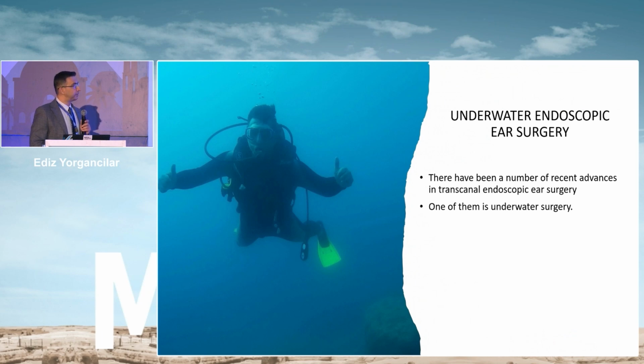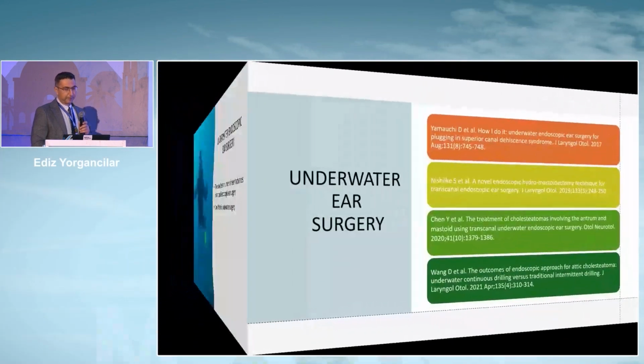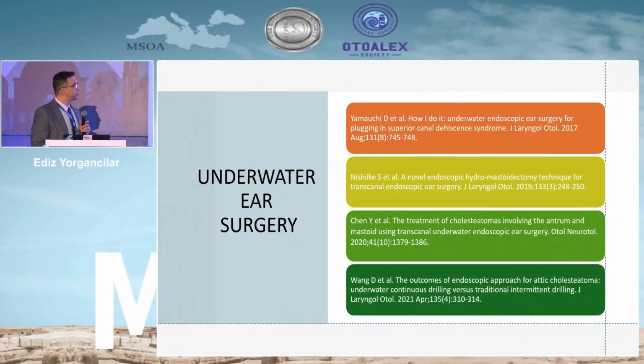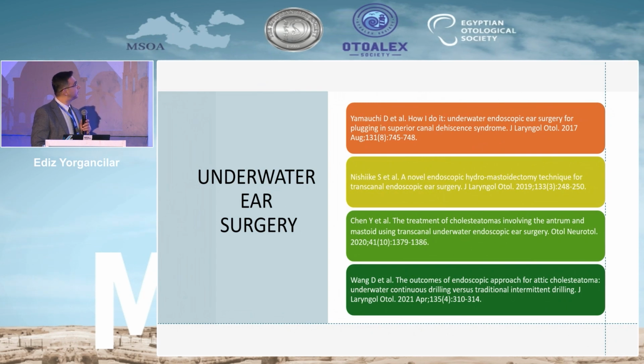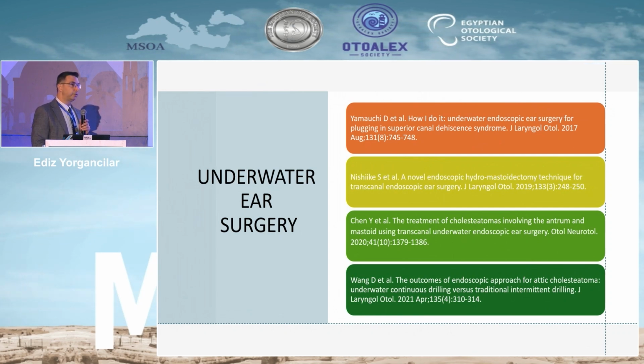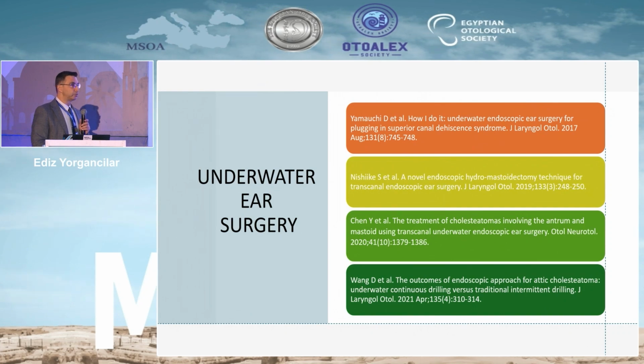One of them is the underwater technique. This picture is from Sharm el-Sheikh. This novel procedure was first reported by Yamauchi for plugging in superior semicircular canal dehiscence, and then Nishike and Chen reported it for cholesteatoma cases with endoscopic use, and Wang compared the results of continuous drilling underwater and intermittent drilling with endoscopic patients.